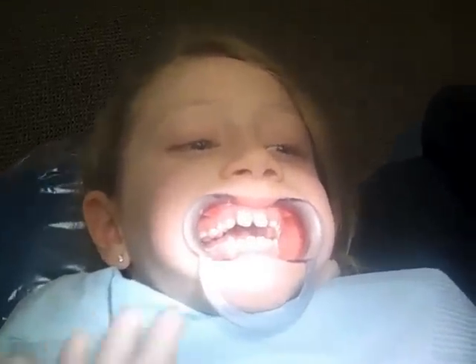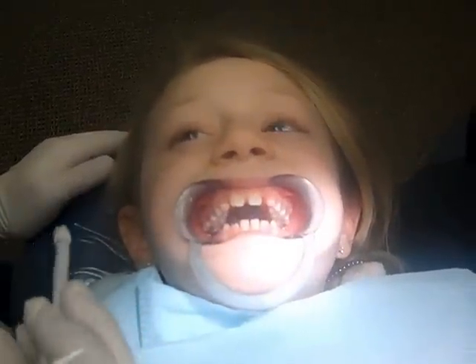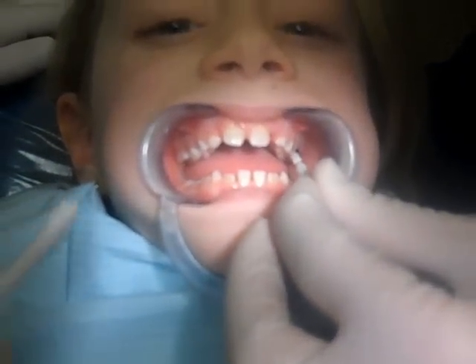For all you fans out there that are waiting, you will definitely get to meet her up close and personal. Open real big — bigger. Now what we're doing — there we go — we're just painting on our glue.